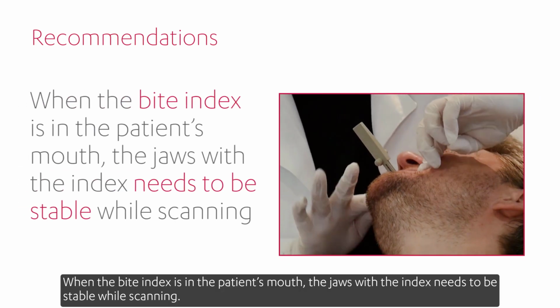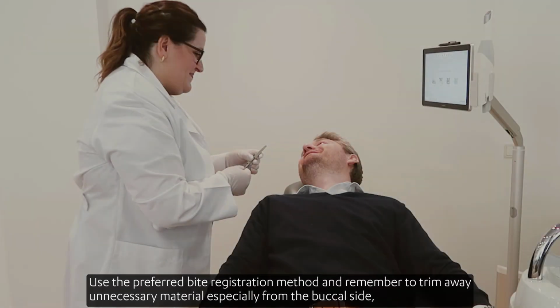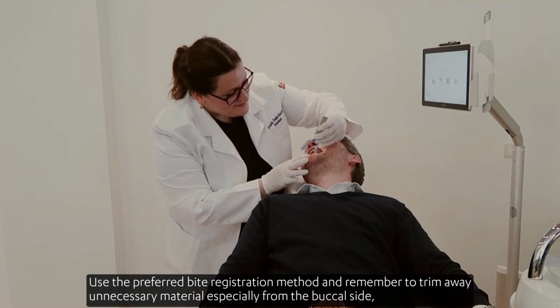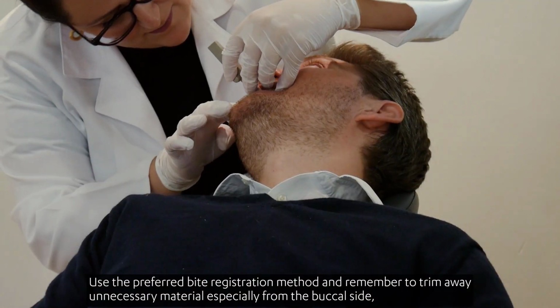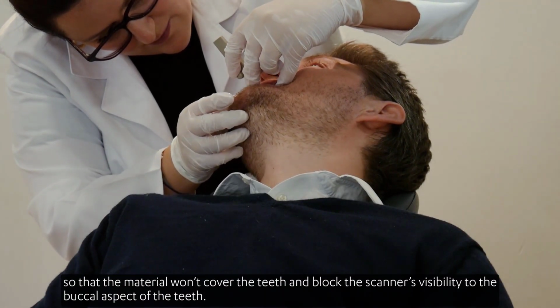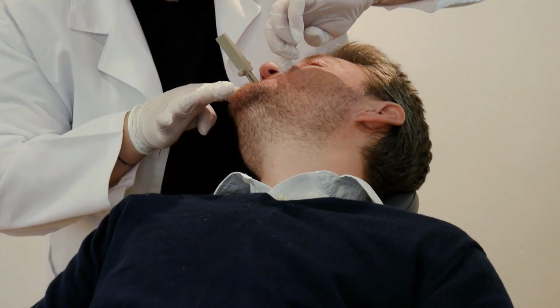When the bite index is in the patient's mouth, the jaws with the index need to be stable while scanning. Use the preferred bite registration method and remember to trim away unnecessary material, especially from the buccal side, so that the material won't cover the teeth and block the scanner's visibility to the buccal aspect of the teeth.